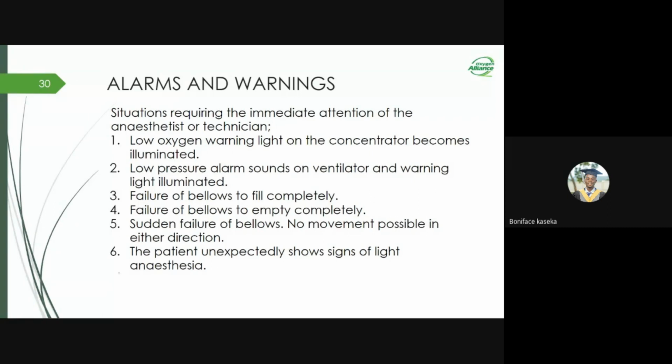And also sometimes it is because the tidal volume setting is actually too low for the size of the patient. To solve this problem, it is good to just look carefully for all sources of leakages and disconnection and make sure that we restore them back to integrity. And on the tidal volume, increasing the tidal volume setting would be important until sufficient pressure is generated.